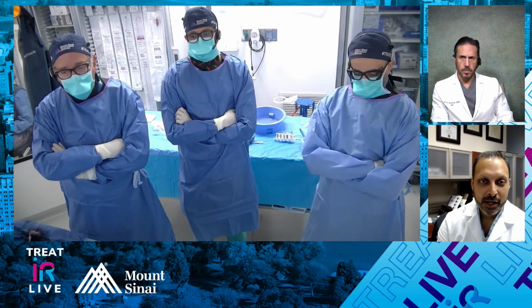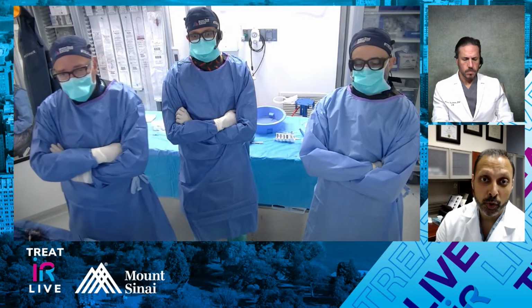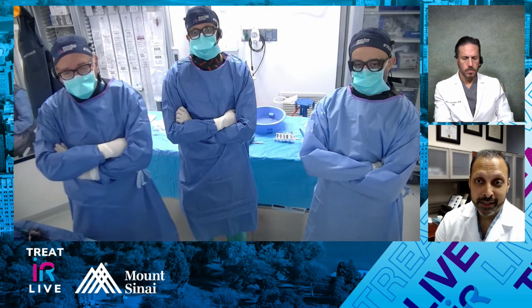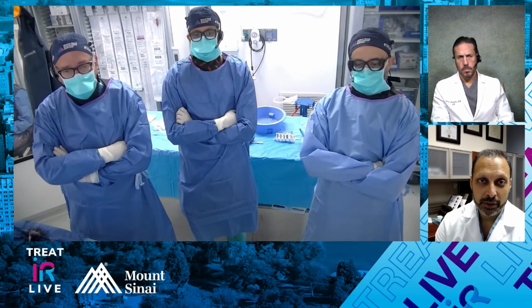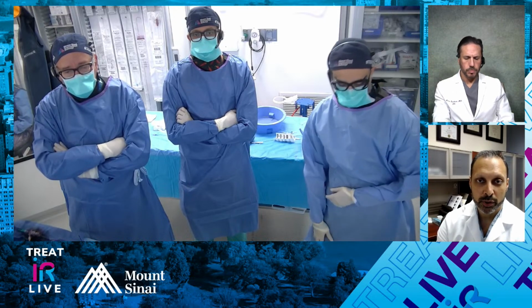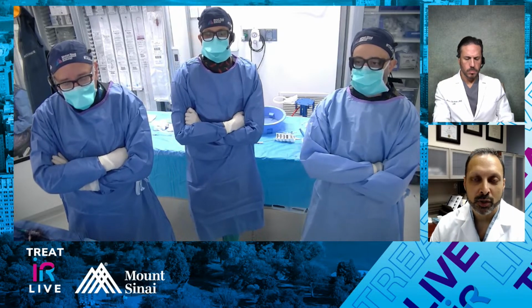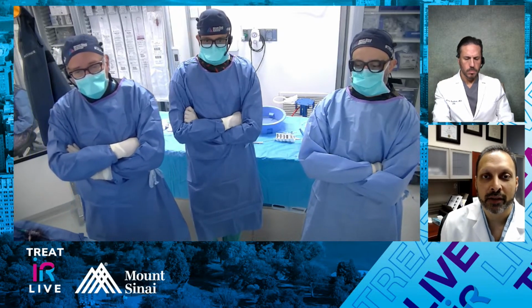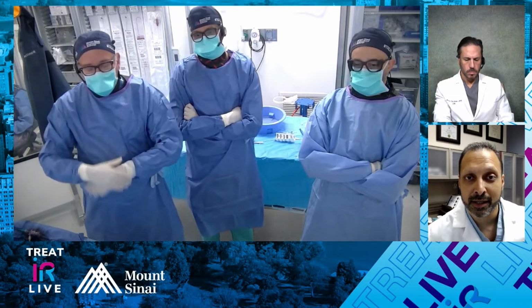So that's one point, but you've addressed that. The other piece here is unique anatomy. You've got bilateral accessory renals, multiple on each side. And it looked like some of them might be sizable. So I'm curious, how are you determining which ones to treat? Is it just the main renals on each side, or are you going to determine, am I going after multiple? At what size are you going to determine this is one I should go after, or maybe leave it be? Because I suspect that's going to be something you're going to address on the table today.